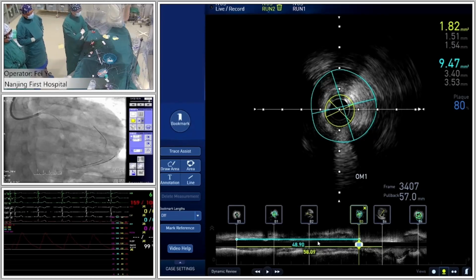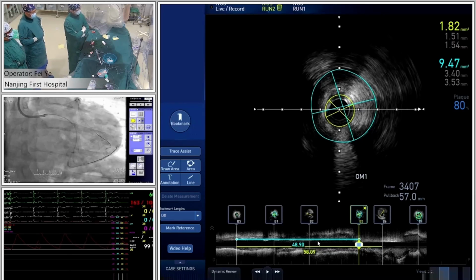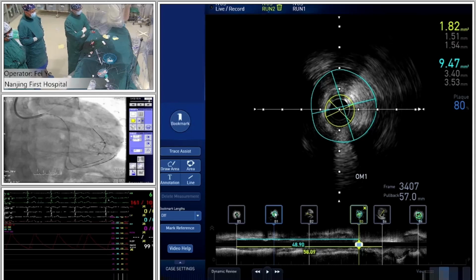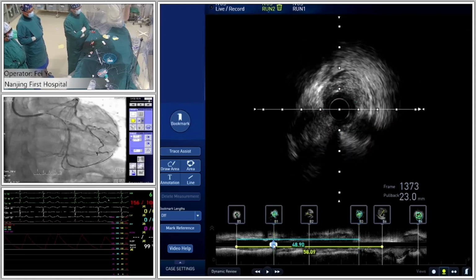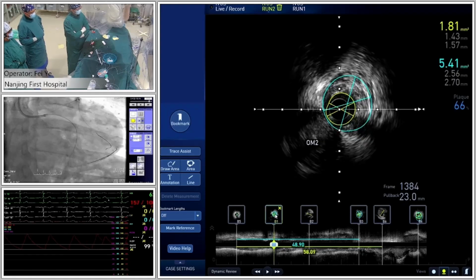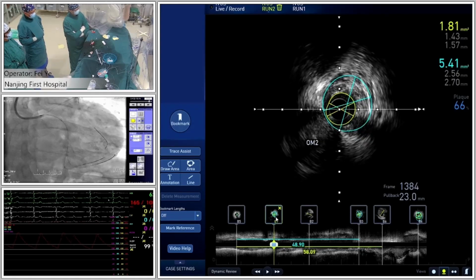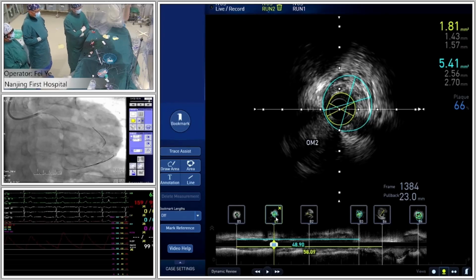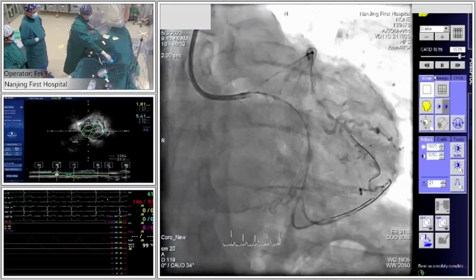After we successfully cannulate the distal CTO and pre-dilate, I will show that the distal circumflex and the OM2 is also a true bifurcation, although it's a simple bifurcation according to the definition criteria. From the IVUS imaging, maybe the distal circumflex vessel is a little larger than the OM2. So Dr. Yeo, what's your strategy for this typical simple bifurcation lesion?